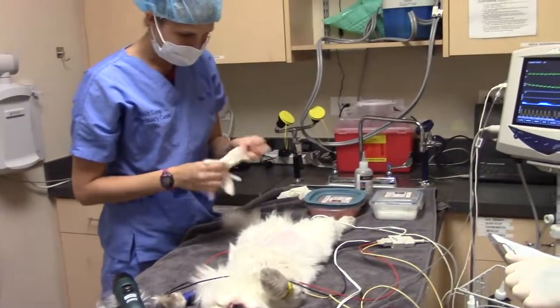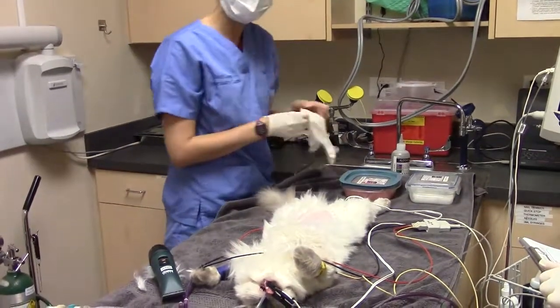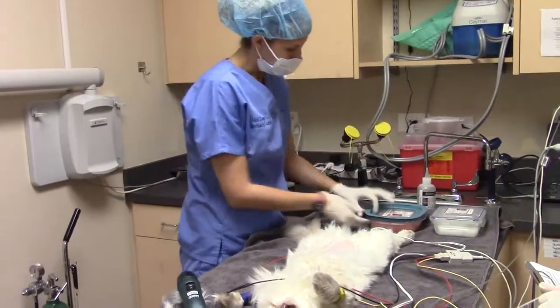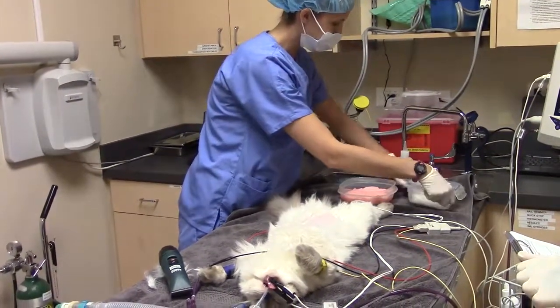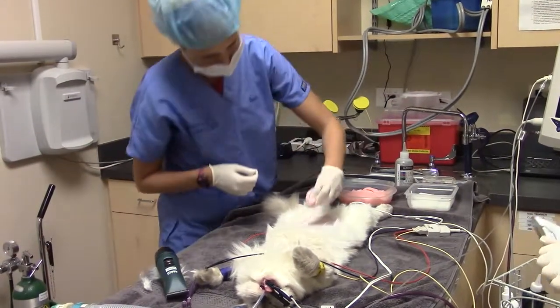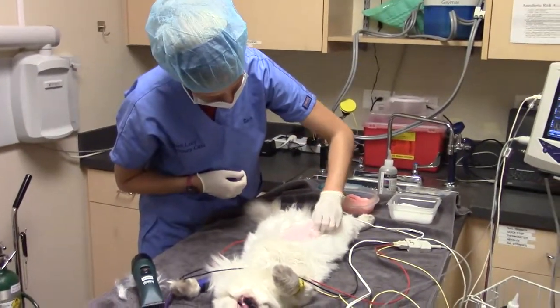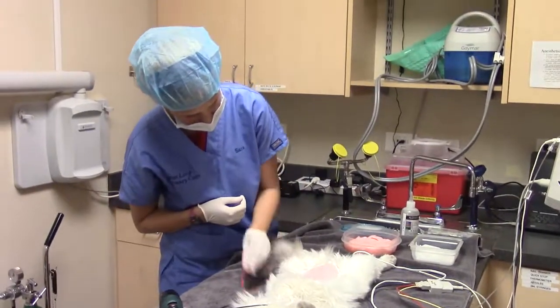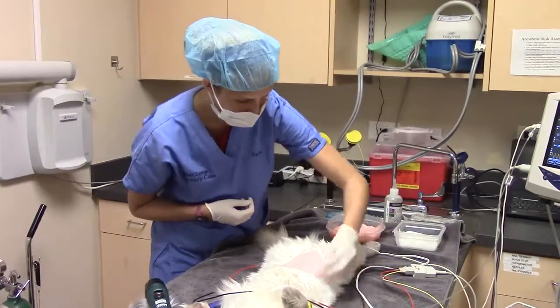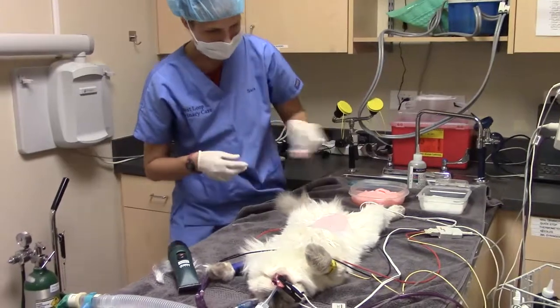Now we'll go ahead with our scrub. Each time after I do a round of the scrub, I'm just going to throw that out so I make sure I'm not reusing any of them. We'll start off first with our chlorhexidine. I'm also just going to use this to get the big pieces of hair out of the way. I'm not touching anything that I've already scrubbed.